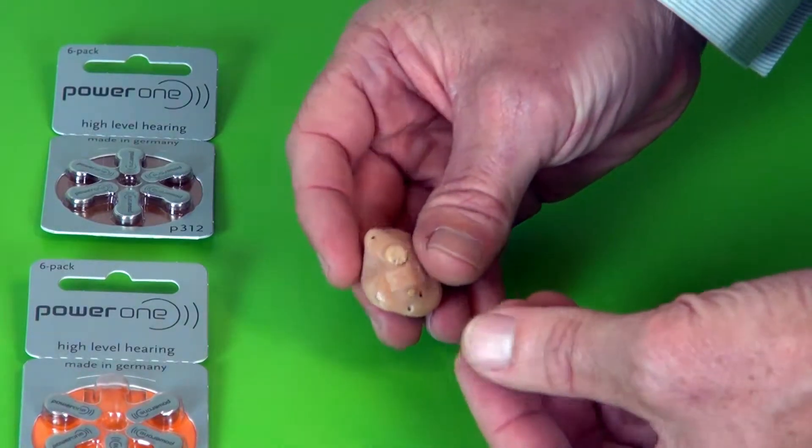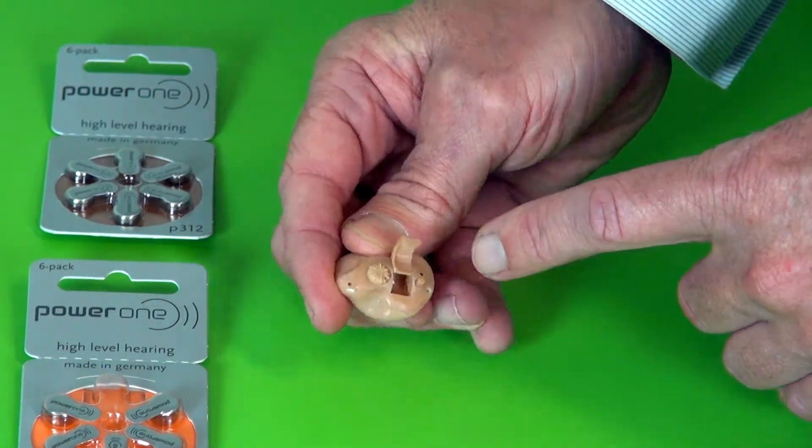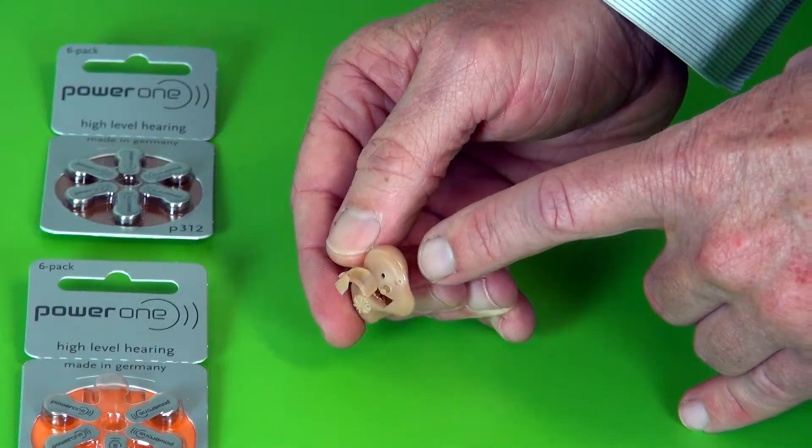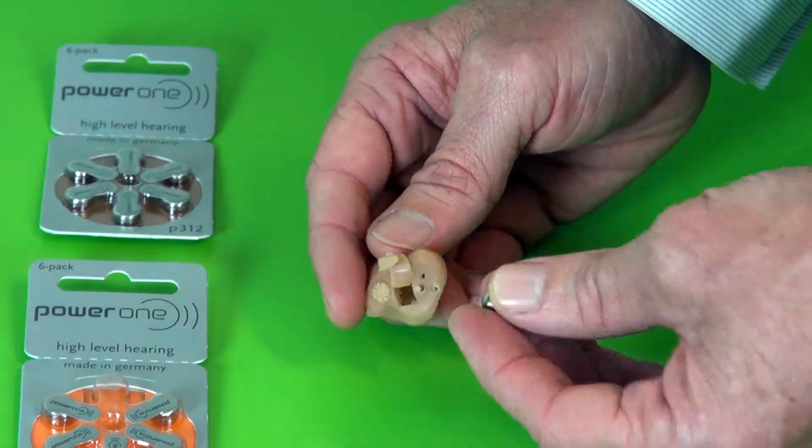To put it into your hearing aid you need to open up the battery door. On the battery door there is a little shelf and then a nice open surface. The side with the shelf you will put the ring on.